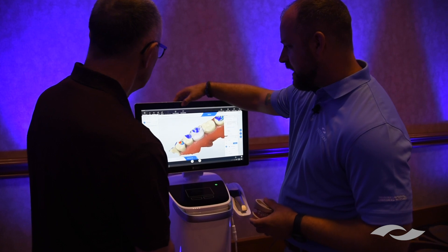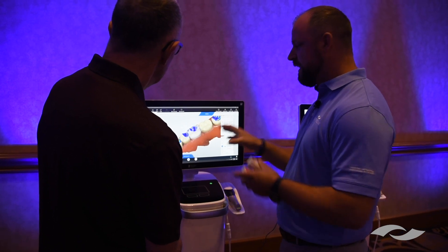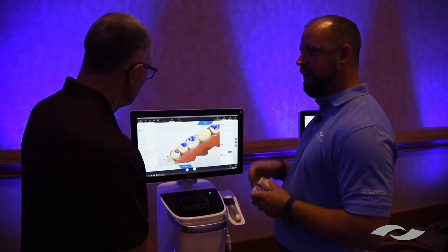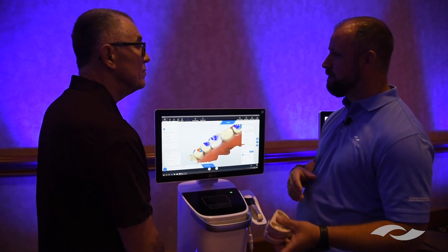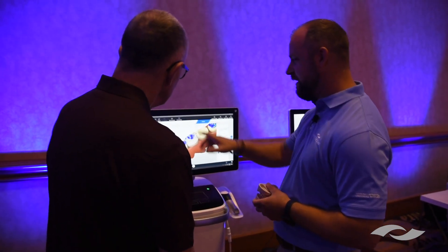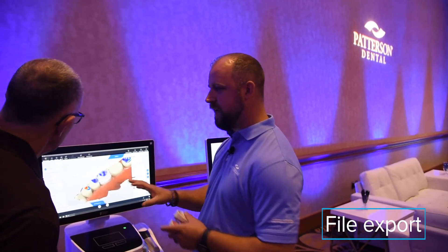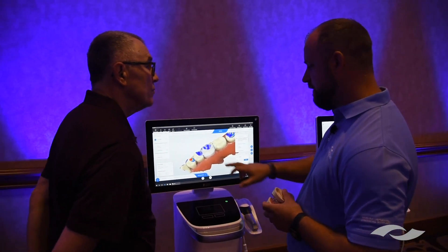Down here is what I call my Connect hotlink — it says Sirona Connect. Once you open this menu and click it, it opens the impression inside the Connect software so you can send it out to your lab. They have it in less than two minutes. You can call your lab and confirm they have everything to complete the case while the patient is still there. You can also use the Connect chat to chat with your lab. You can also export your files right from here — if you wanted to export the model as an open STL file for 3D printing, you could do that from this step.